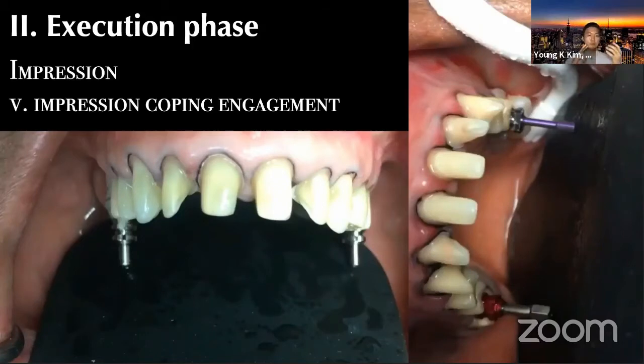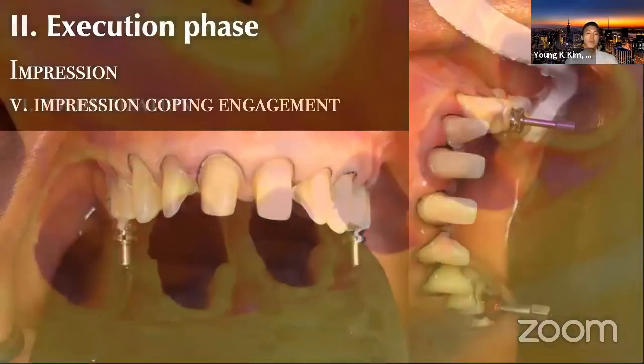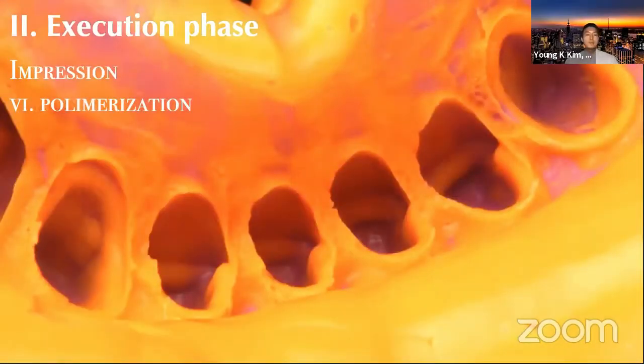So saliva control is absolutely critical. Before taking the impression, I selectively block wherever the major salivary glands are with dry angles, proper suction tip alignment, and even dual side suctioning if necessary. If the patient salivates a lot, then you can even prescribe anti-salivary medication before the final impression visit, and I occasionally do.